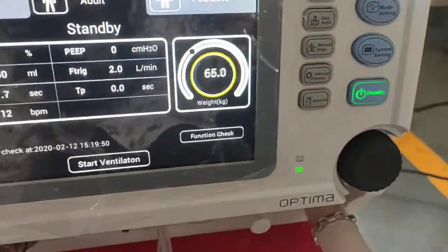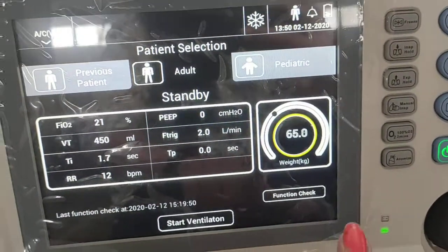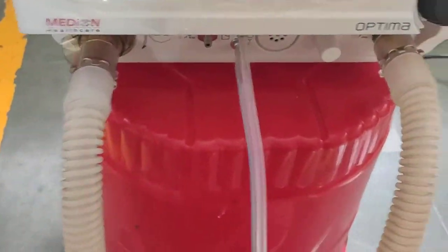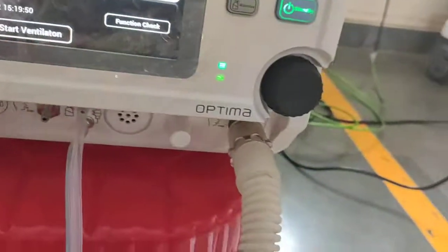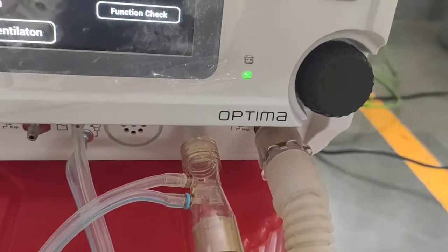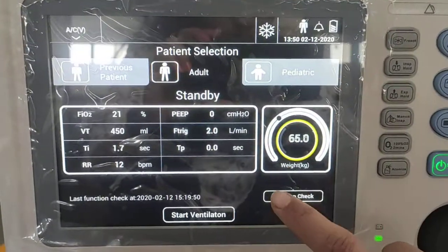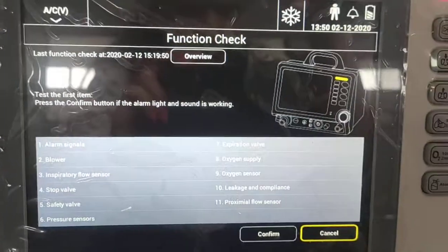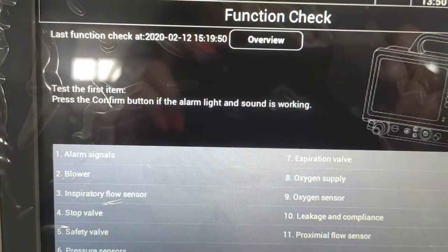Before starting ventilation, first we have to do the functional test of the machine. To do the functional test, connect the patient circuit and the flow sensor. A test plug is provided, so connect the flow sensor to this test plug and start the test.